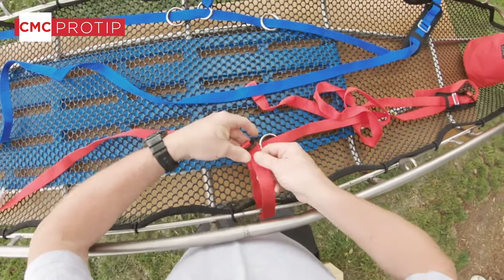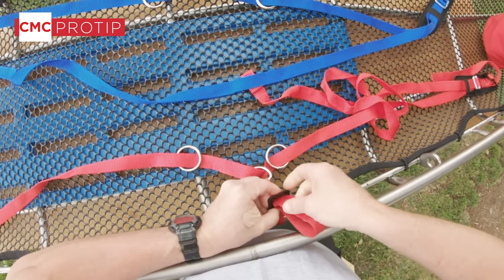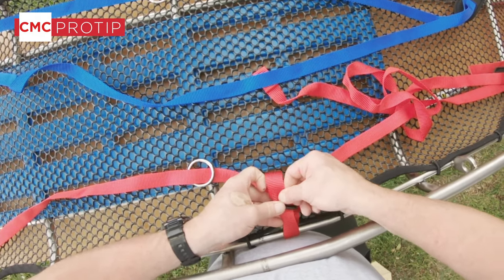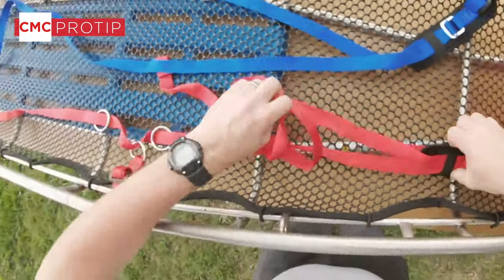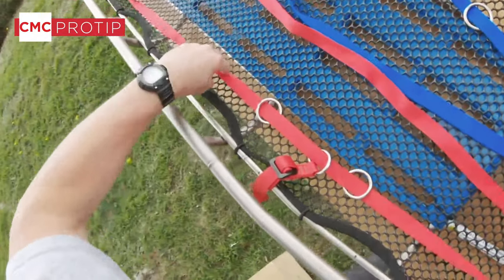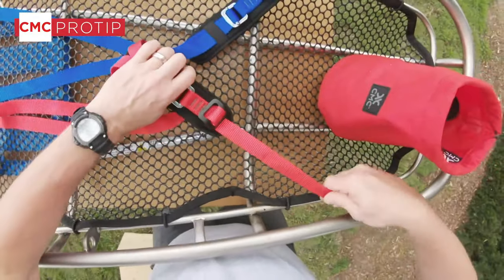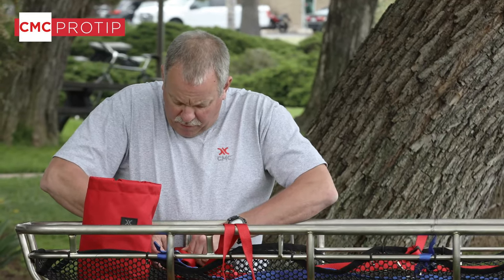Again, our second strap goes near the waist. Just like before, we make sure this is straight. We go ahead and attach the foot end. We technically can put this on either way, but we definitely prefer the adjustable end at the feet whenever possible.